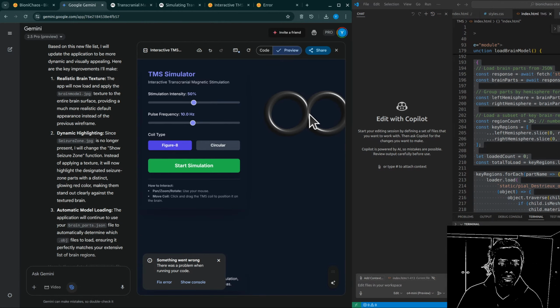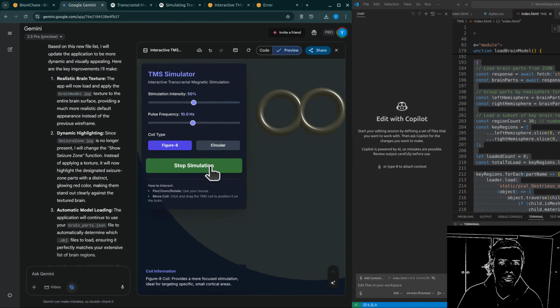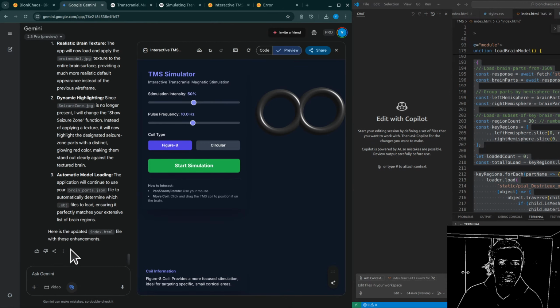Exactly. It helps validate and refine the head model, the coil model, the E field calculation. It's a way to ground the simulation in something directly measurable, even if it's a relatively simple physiological response. That makes a lot of sense. Use something you can measure reliably, like an MEP, to check the accuracy of the earlier stages of your simulation before trying to predict something harder. Precisely. It builds confidence in the underlying physics and anatomical modeling.